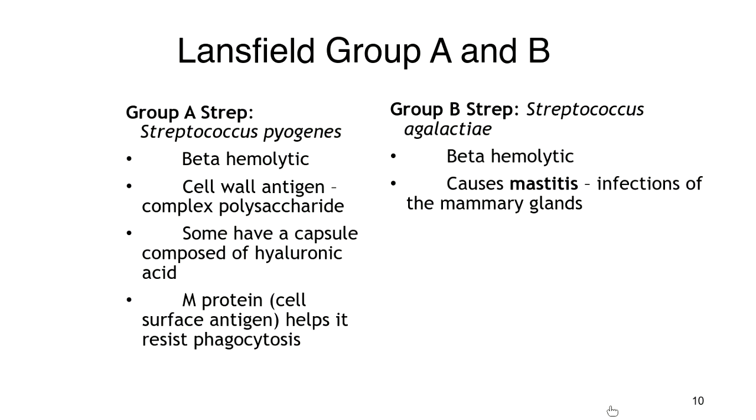So a Group A strep, Streptococcus pyogenes, pus, purulent material. Streptococcus pyogenes, again, genus, species in italics. Again, we said that all of the groupings A, B, C, F, and G are beta hemolytic. So again, you can look at that hemolysis pattern and understand what that means. Okay, beta hemolytic. So group strep A's are beta hemolytic.